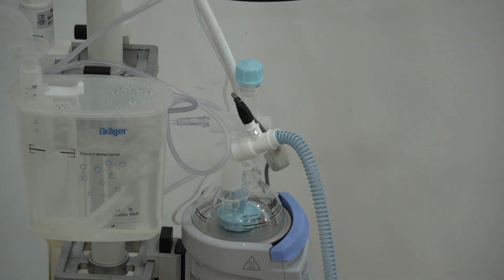But I completely agree with Linda that you always have to look at the baby. How is the baby's saturation? How is the baby's work of breathing? Is the baby struggling? Is the baby comfortable? Is the baby fighting the ventilator, or in this case, bubble CPAP? These are all the physiological characteristics that really give you enough information about the effectiveness of the therapy. And I think that's what we need to look at in the first place, checking the baby's condition before making any changes.